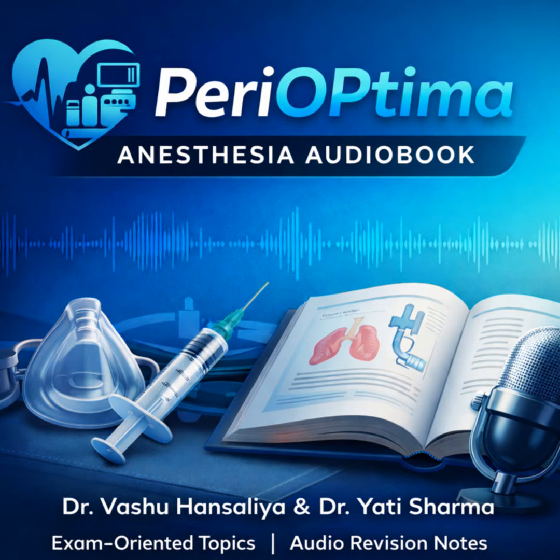So all these systems together, PISS, DISS, screw threads, color coding, they guard against that fundamental error of misidentification at the source. They do. They prevent cross-connection right at the periphery of the machine. Okay, this transition moves us from the outside of the machine into its internal workings. Specifically, the systems that guard against the most critical operational failure you can have, loss of supply pressure.